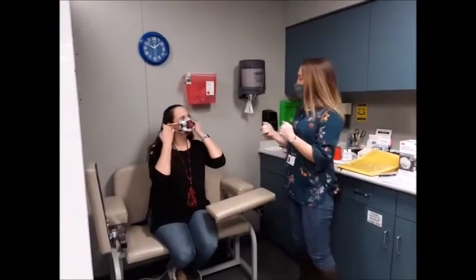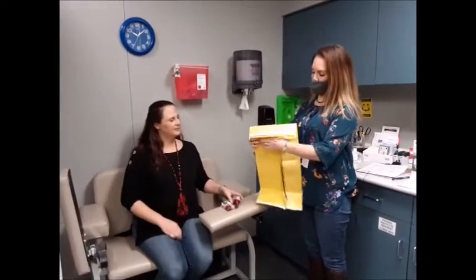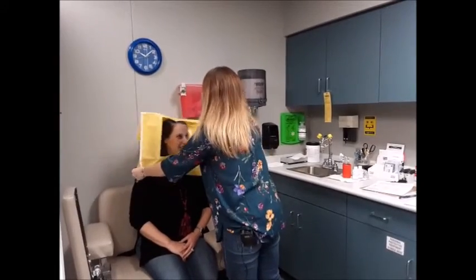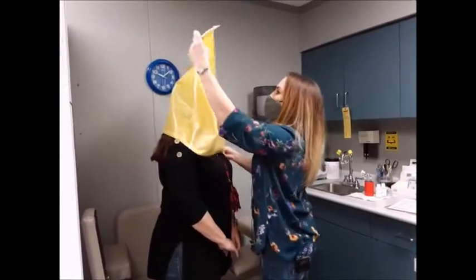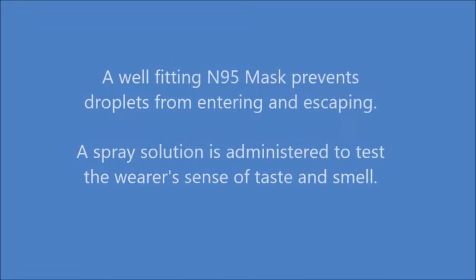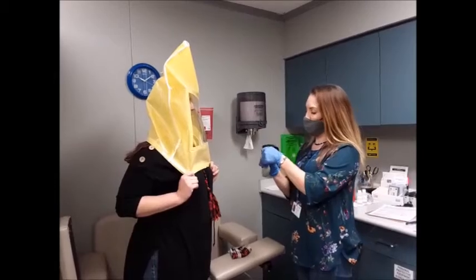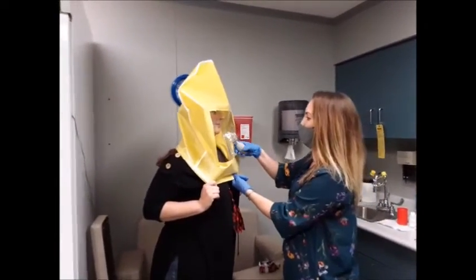I'm going to have you take off your mask and I'm going to place this tent over your head. I'm going to have you go ahead and stand up for me. I'm going to spray it inside there. I need you to tell me when you taste or smell something bitter or sweet. I'm not going to spray this directly into your mouth, but go ahead and open your mouth for me.